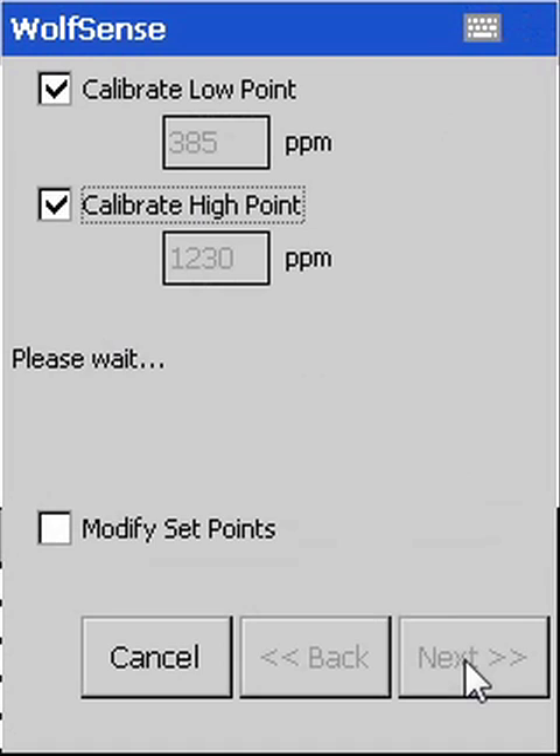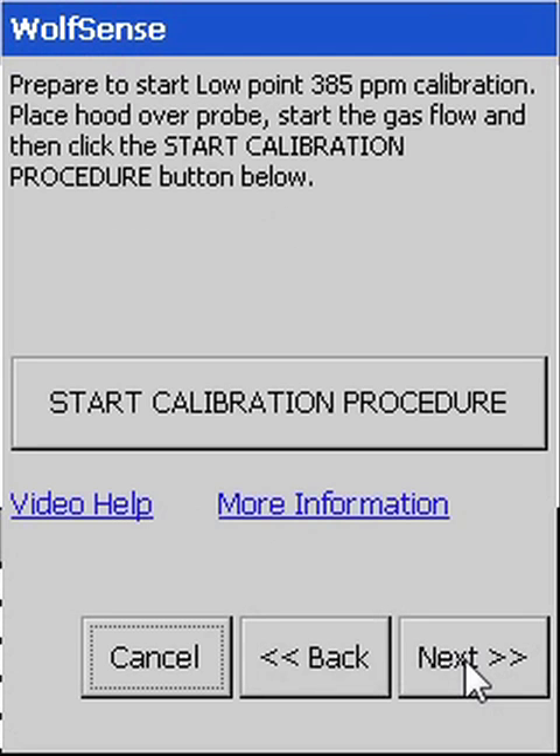Your revised calibration points will be retained for the next time a user calibration is performed. Place the calibration hood over the top of the probe and then open the reference gas regulator.